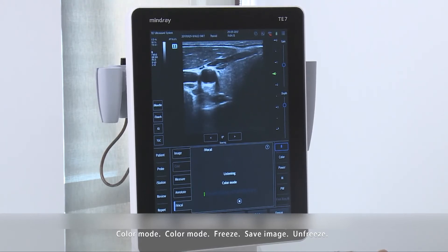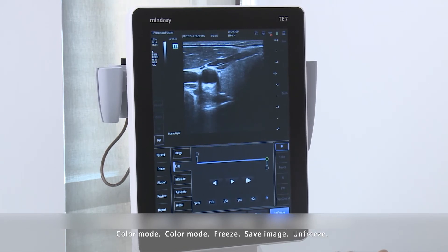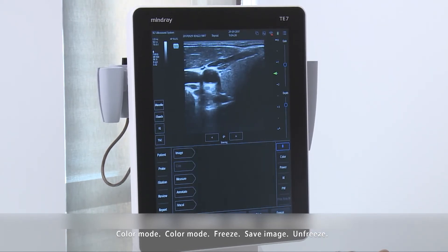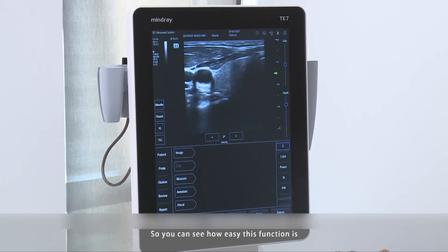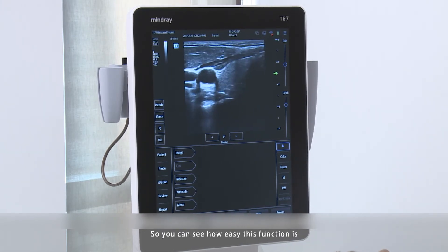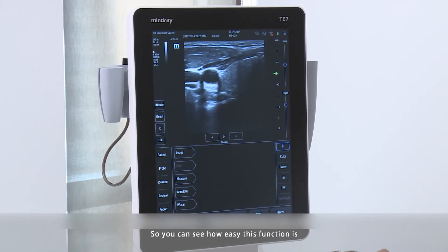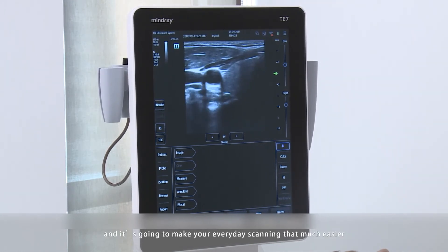Freeze. Save image. Depth increase. You can see how easy this function is, and it's going to make your everyday scanning that much easier.